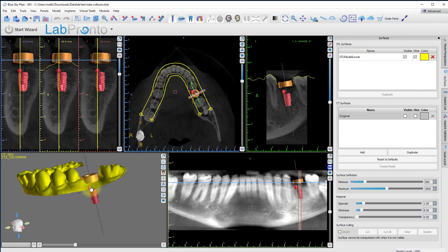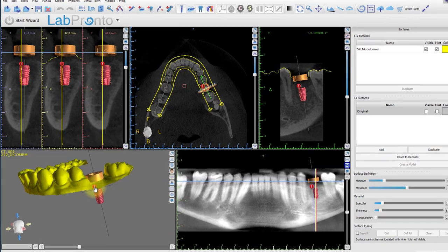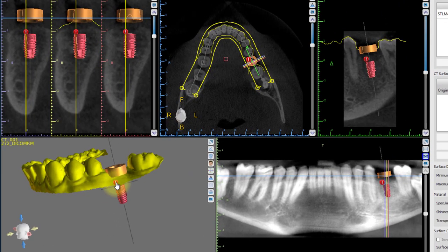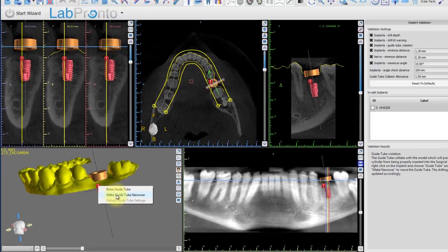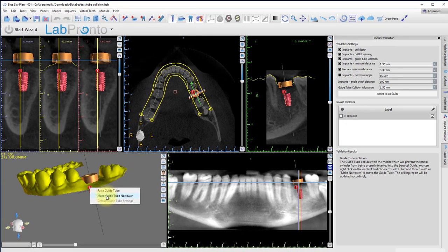The software senses an issue involving the implant as illustrated by the red exclamation mark. When we click on the exclamation icon, a collision drop-down appears by the implant with the suggested solutions. Raising the guide tube will lift the guide tube off the model; making the tube narrower will reduce the diameter of the guide tube in order to fit between adjacent teeth. The implant validation panel also opens showing more details regarding the collision, as well as mentioning that the drill report will be updated automatically.